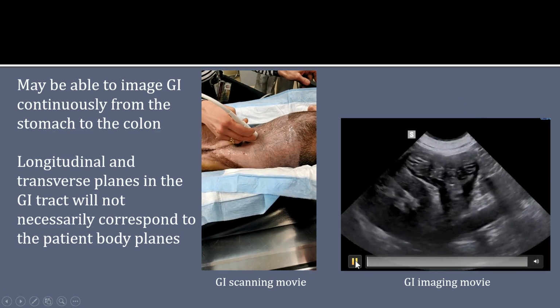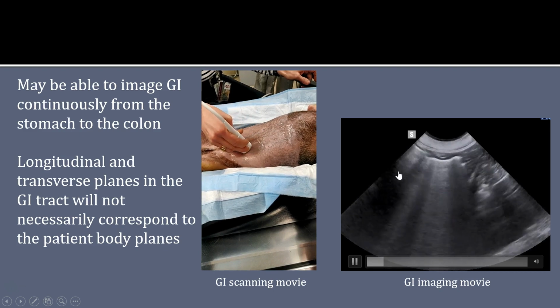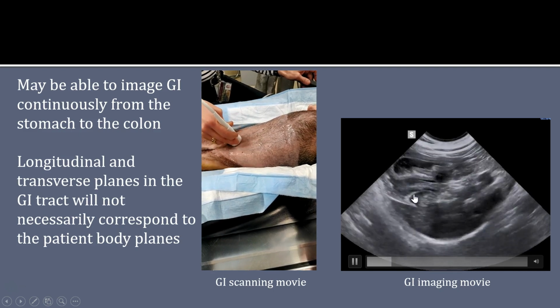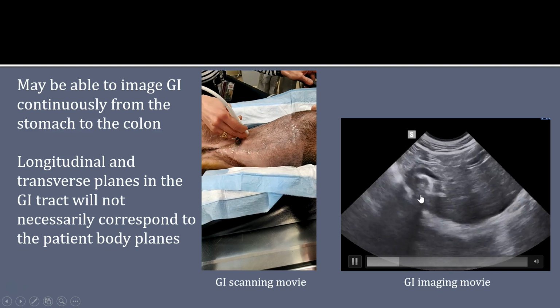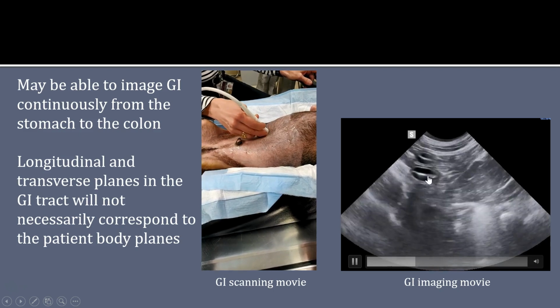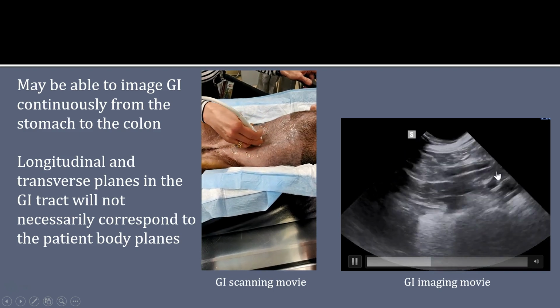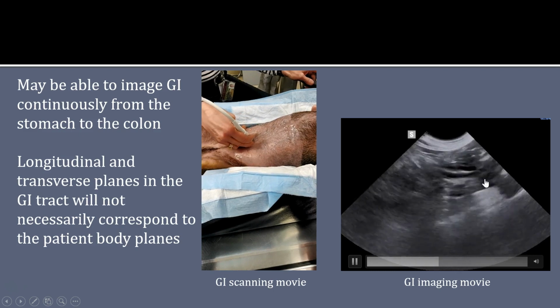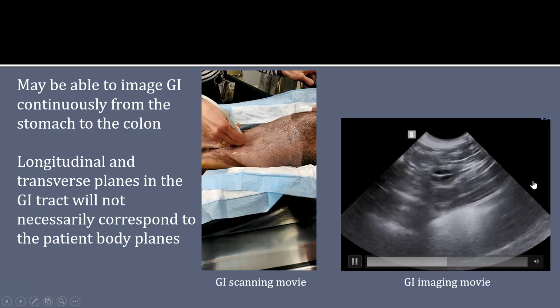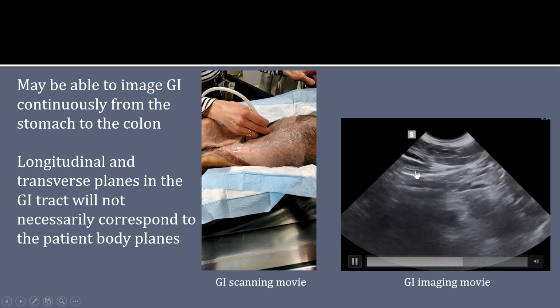On the right side of the slide is an imaging movie that's showing the stomach in transverse, and then we can follow it into the pylorus, out into the duodenum. Watch that, sometimes as I'm imaging here, I'm on the transverse, and then I'm on the longitudinal. As I go down, I lose it a little bit, and then I have to come back. So I'm making all these small movements and changing up quickly, trying to make sure I don't lose it.